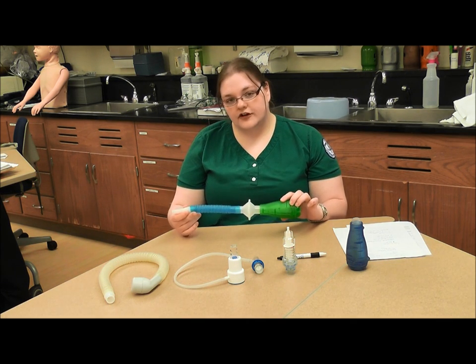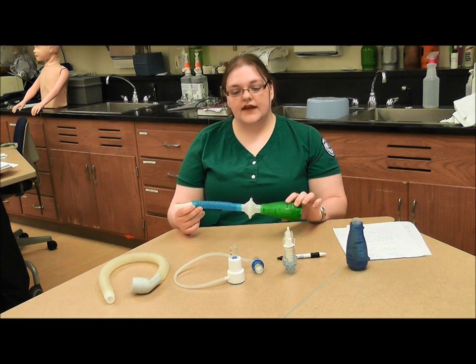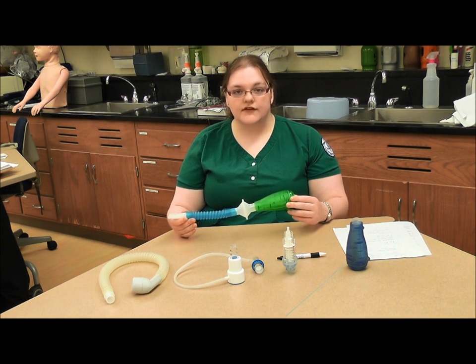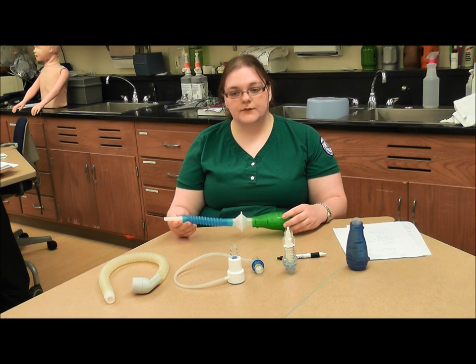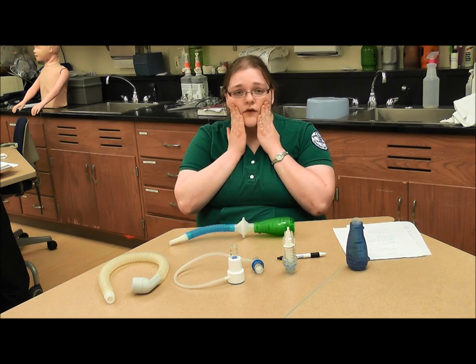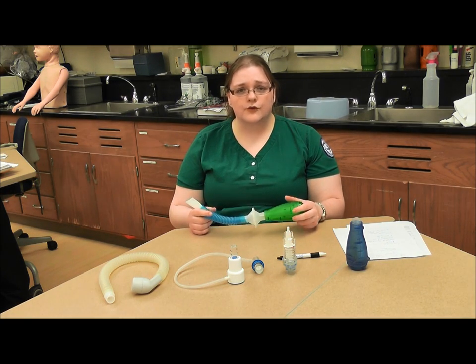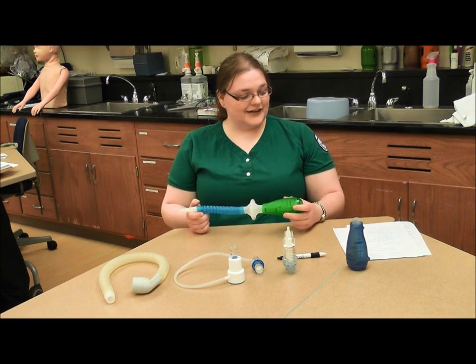You also want to instruct your patient not to puff out their cheeks when they're blowing against the pressure. If they have to do that, you might need to reduce the resistance on the device. You want to keep cheeks normal. If they're having trouble, tell them to hold their cheeks when they do it.